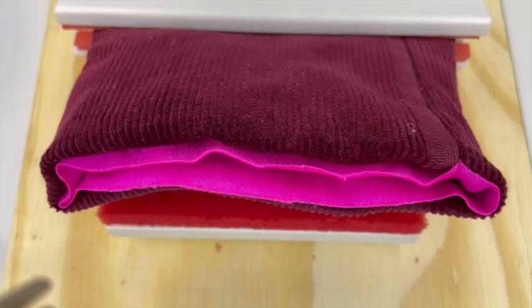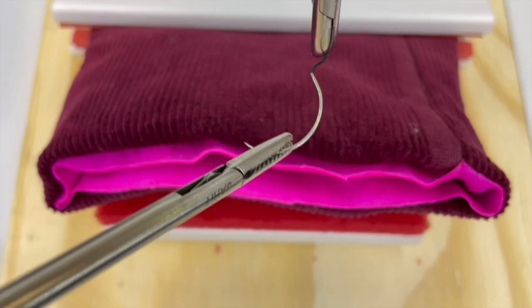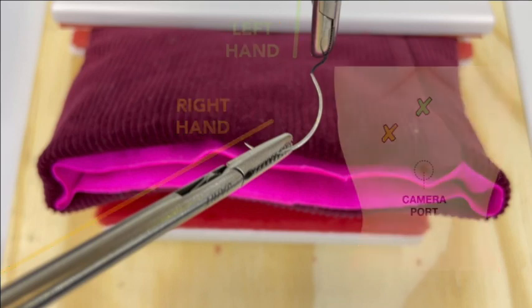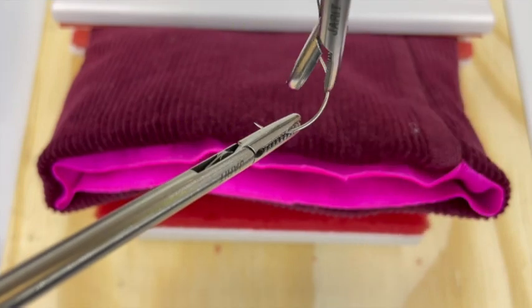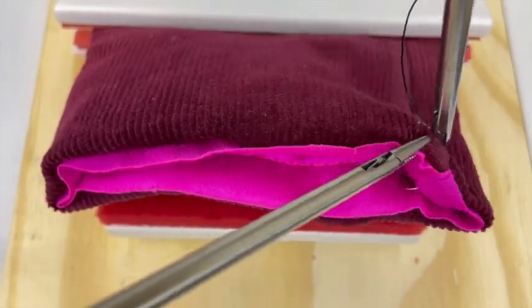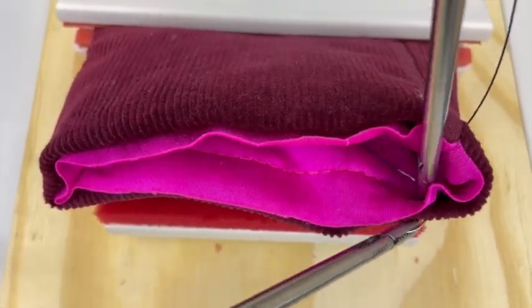The midline port configuration demonstrated here involves standing on the left side. The right hand is located in a suprapubic port and the left hand in a left lower quadrant port. The surgeon may prefer to utilize their left hand through the midline port depending on hand dominance and comfort. For optimal ergonomics, we recommend beginning at the right apex and suturing anterior to posterior sequentially towards the left apex.